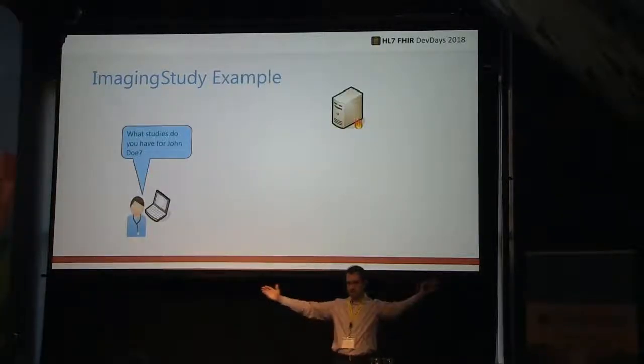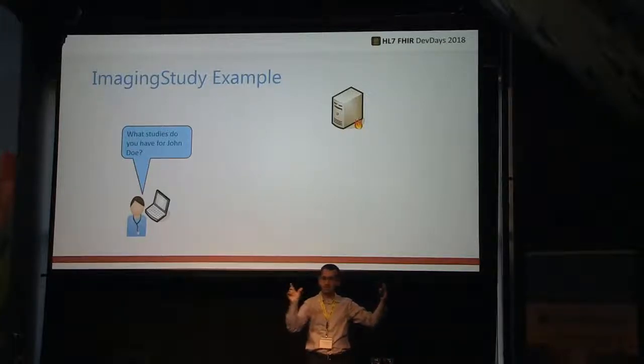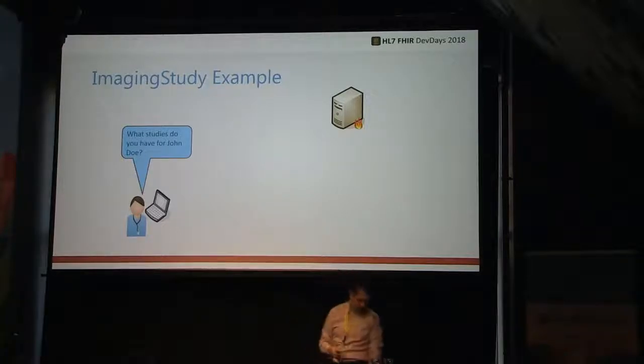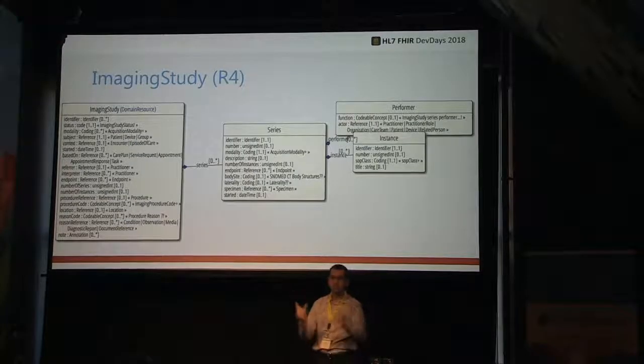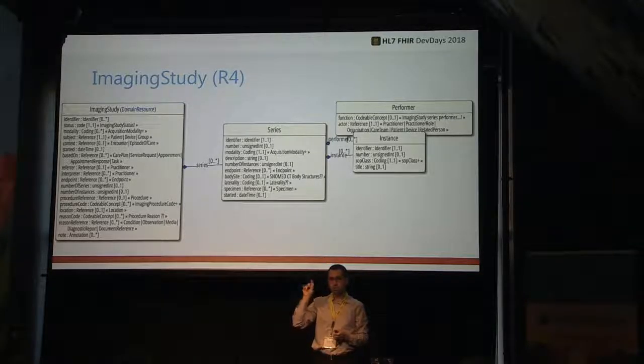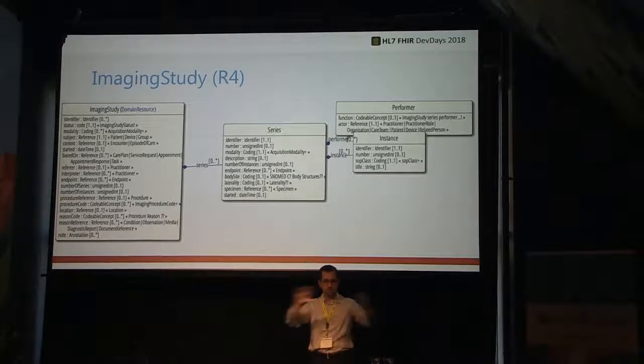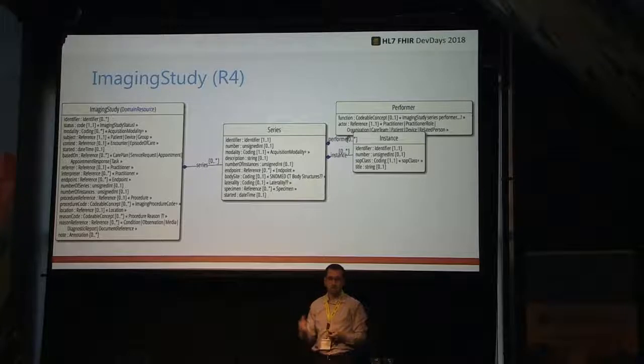Let's say I have a stack of images. I have 100 images of CT, okay, and I want to be able to choose one that I think is representative of whatever observation I made. Oh yeah, this is the cancer right here. So you choose that, and then the PACS will generate a key object selection document, and all that document does is just tell them that this is the most important image in this entire study. So that's one example, but you may also have other metadata objects.